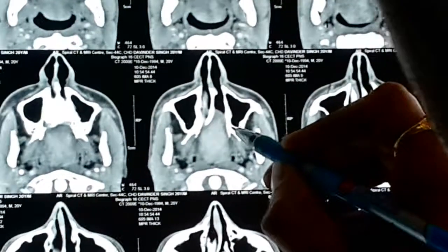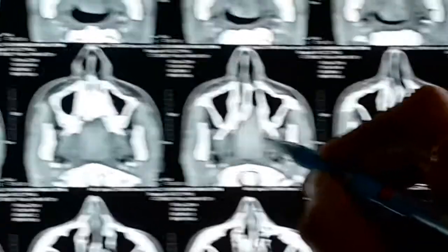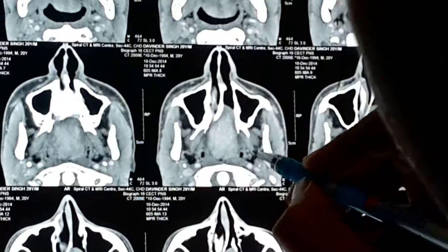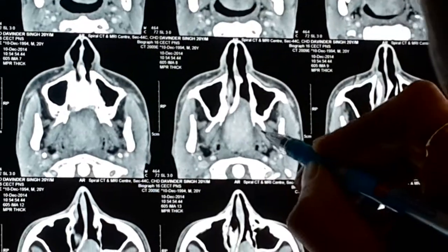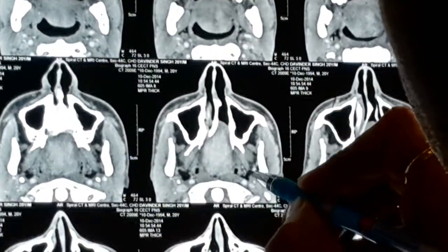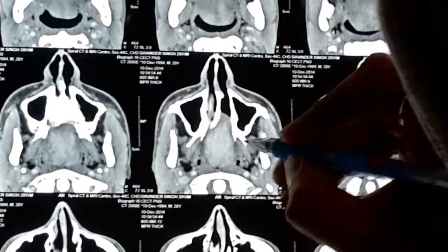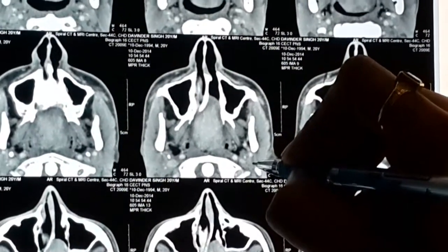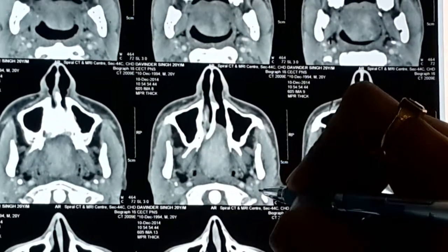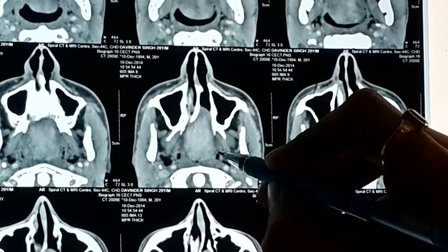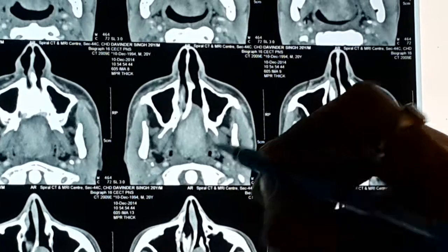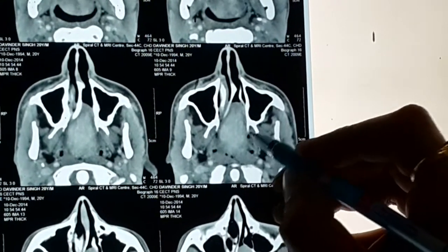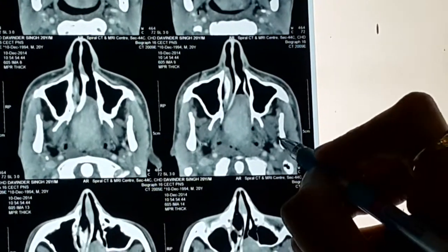This is the pterygoid process, and the medial and lateral pterygoid plate. This is the medial pterygoid muscle, going down to the ramus of the mandible. This is the region of the eustachian tube. Coming up — again see the pterygoid process is intact. This tumor is limited in the nasopharynx.